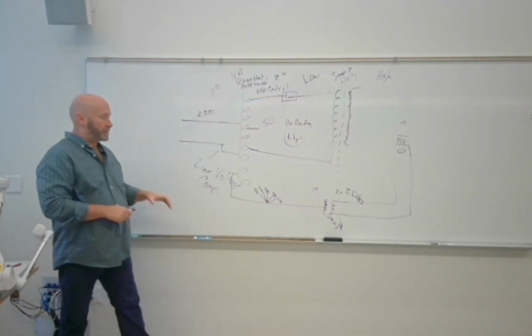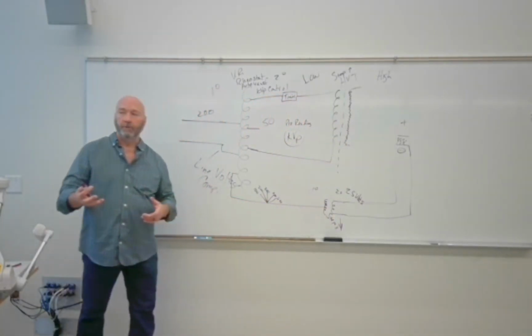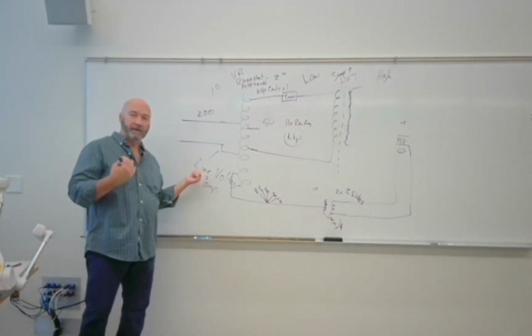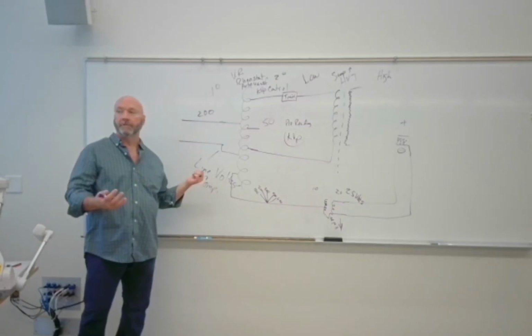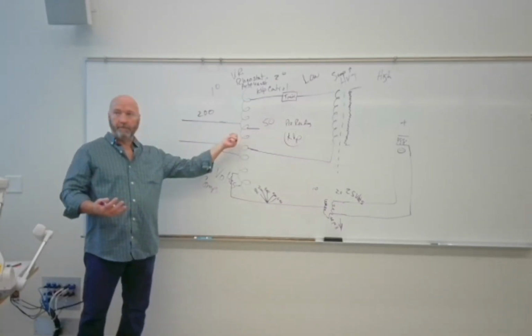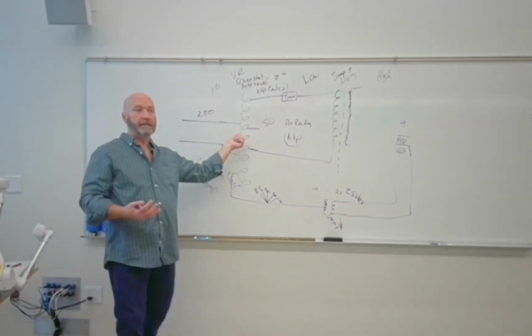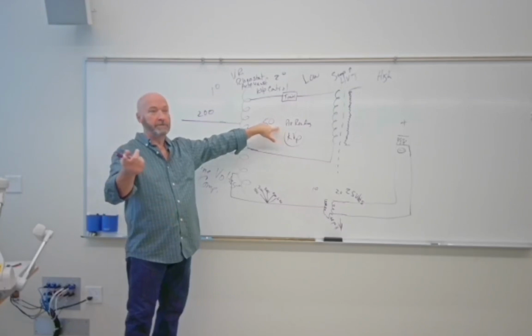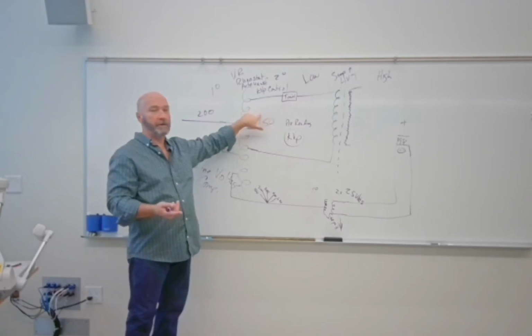Okay. So what do we control from our control panel? Well, there's line voltage compensation. You're not going to see that unless it's on a single phase machine. You control your KVP by adjusting the contacts on the low voltage side of the autotransformer.